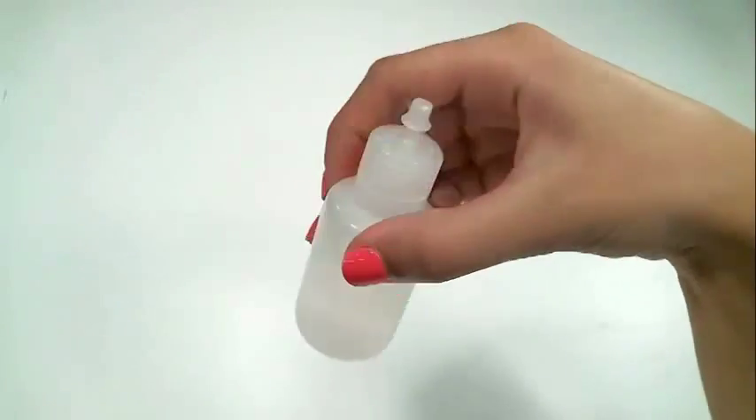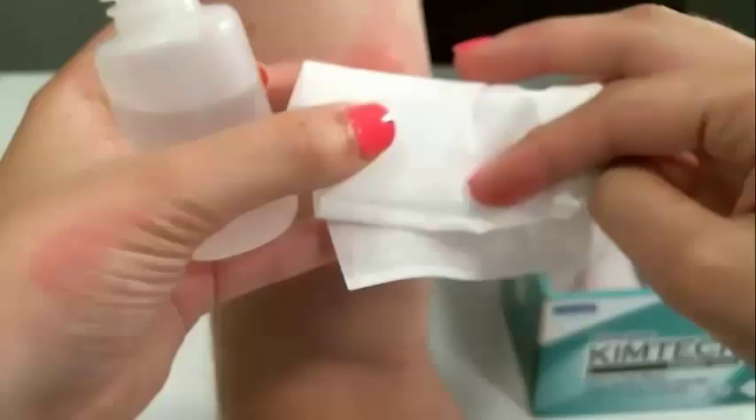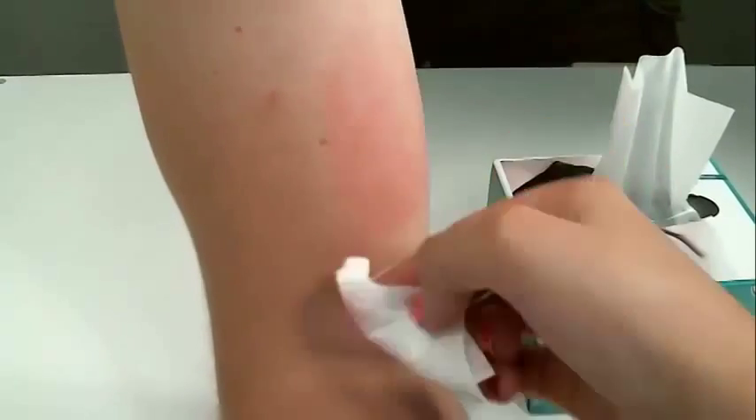Next, wipe the abraded area with alcohol or another Kimtech wipe to remove any NuPrep leftovers. Let the alcohol dry for a couple of seconds before attaching the electrodes. Once clean, do not touch the area. Excess oils from your hands means that you will need to re-clean the site.